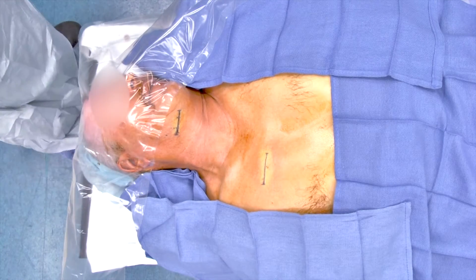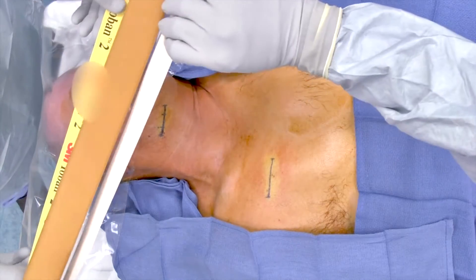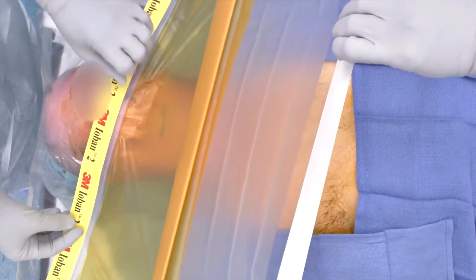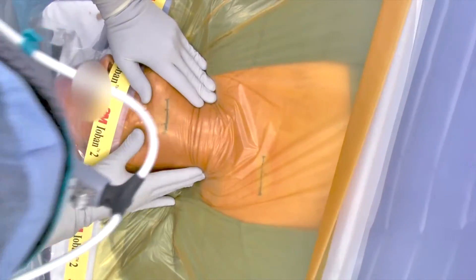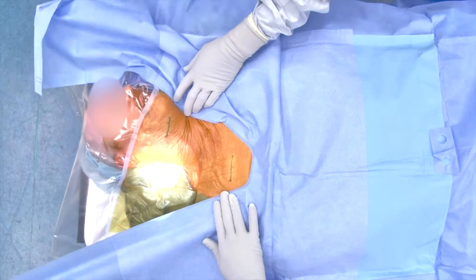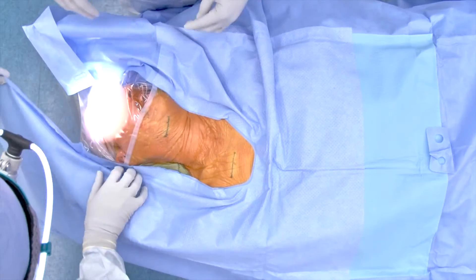And then we're going to follow that with the ioban, which is done by the aid of an assistant. We'll start towards the face and have them pull the ioban inferiorly and then compress the ioban onto the skin. Sterility is extremely important in this operation to avoid any chance of infection, which is obviously a big disaster for these patients. So we do everything we possibly can to stay as sterile as possible.